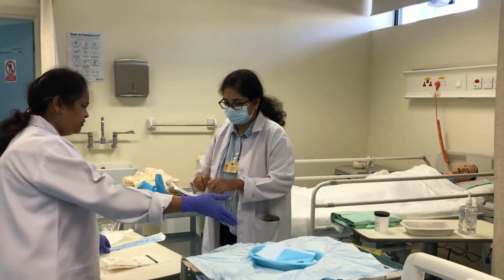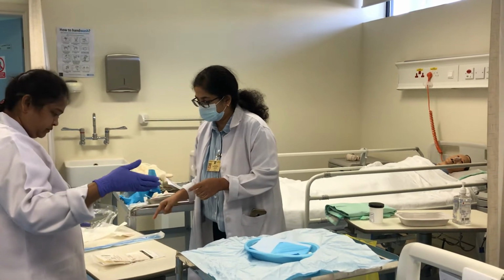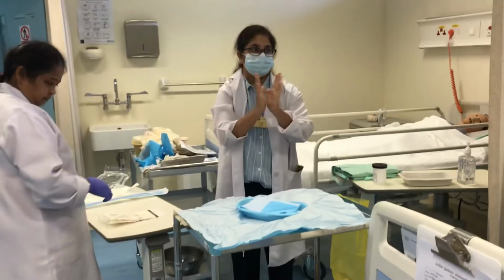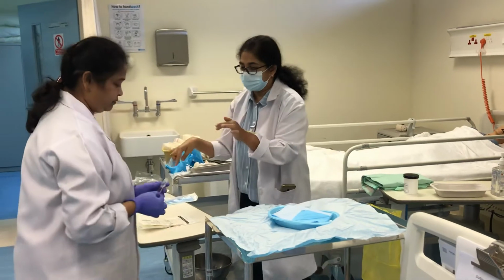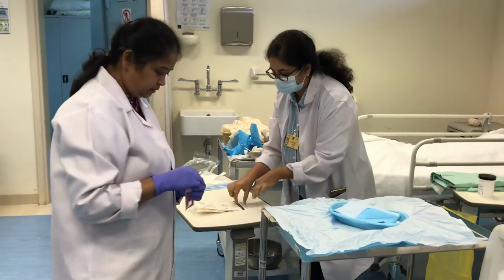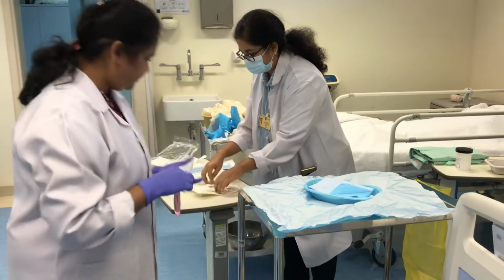You need to open anything in the bag, otherwise when you put, sometimes it will fall down. I've washed my hands after surgical hand washing. I'm going to wear the gloves. We'll do it as 2 people so that it's faster. She can start with the glove and give her other things from outside.